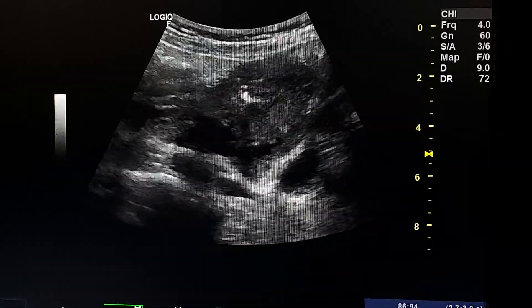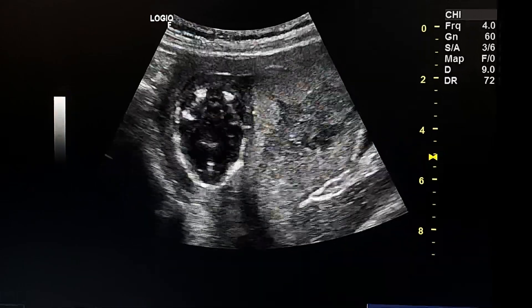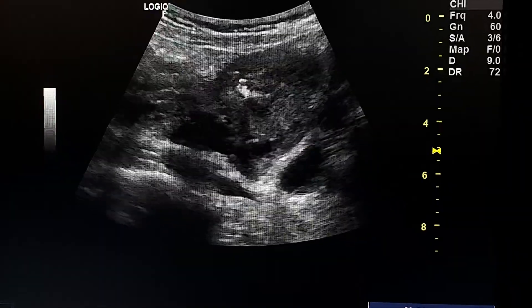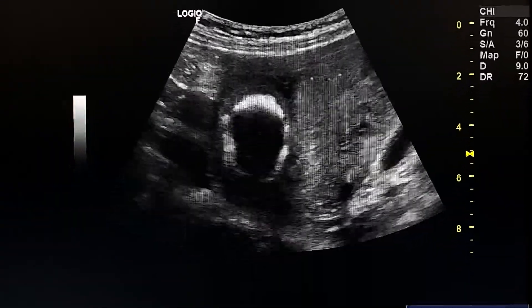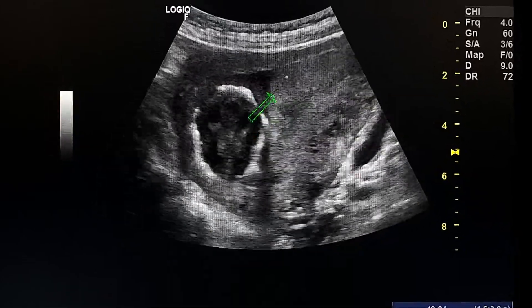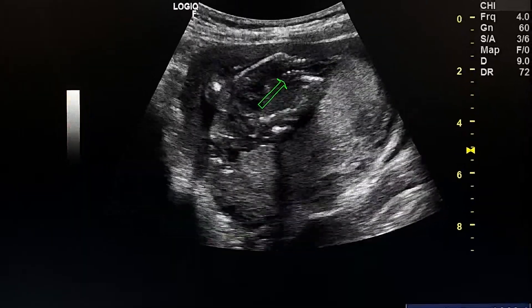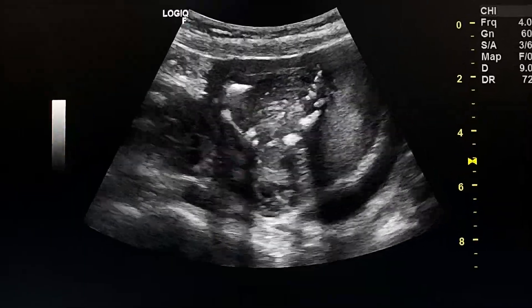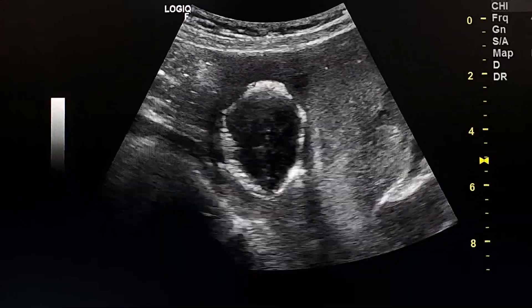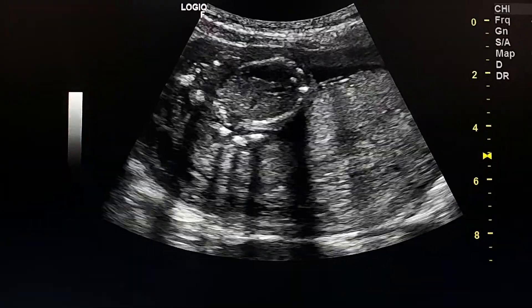This is an ultrasound case of a 16-week fetus with severe oligohydramnios. This is the placenta and this is the fetus — we see a very small amount of amniotic fluid here. The shape of the skull is abnormal, so I checked the spine.